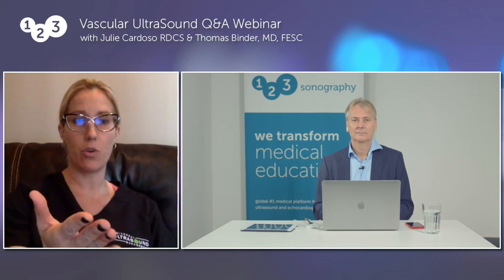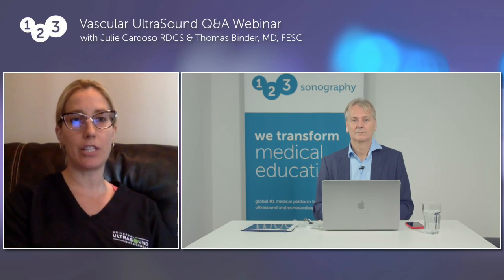To see if we can get this vessel to close off this pouch of the pseudoaneurysm and then reassess it. We evaluate these patients. We do this compression maneuver first, and then we'll reassess them a couple of days later. At that time, usually the physician takes them off of anticoagulation, so the pseudo will close. So we'll evaluate the patient the next day.